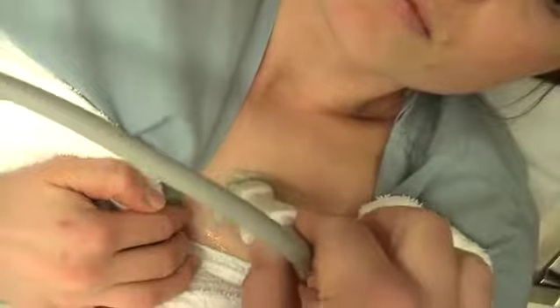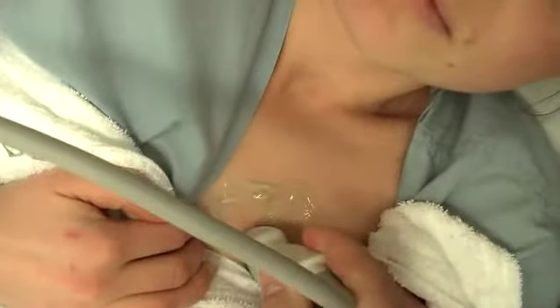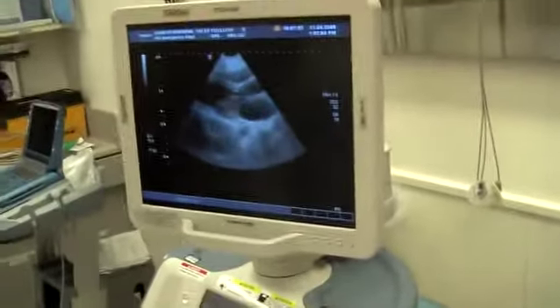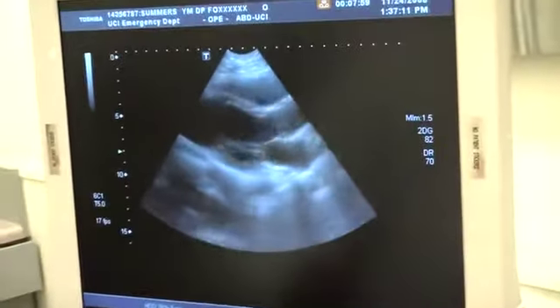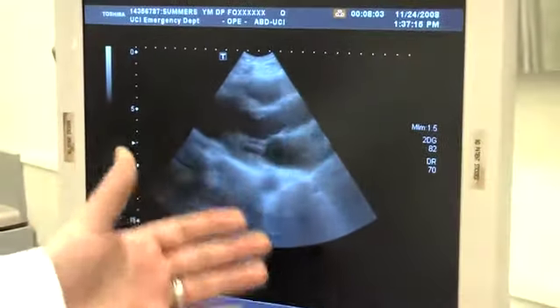And there it comes into view. So she's a good example of somebody who it was difficult to acquire a subcostal image but has a great parasternal long axis view. I will say on this image that because now we're right on top of the heart, whereas before we were going through the liver, my depth is too deep to image the structure of interest. So I'm wasting all of this real estate down here.